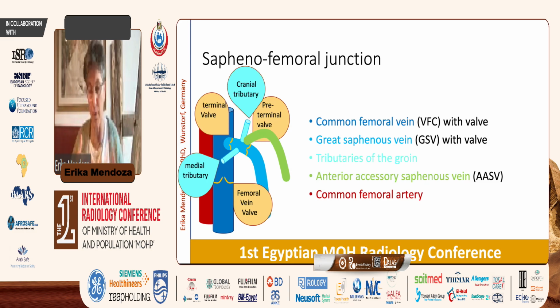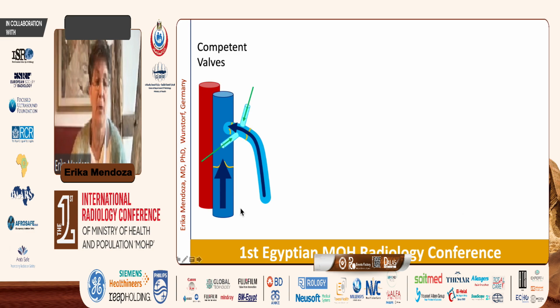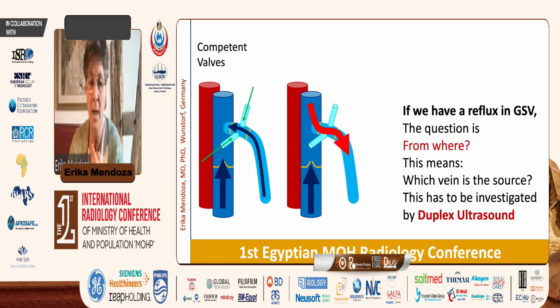The posterior normally is a little bit further down in the leg, so the anterior is the one most important for pathology. And we have the situation with competent valves, where we have antegrade flow in both. And of course, the one draining from the epigastric vein will be footwards, but physiologic. This is very important to have in mind. And then if we have a reflux here in the great saphenous vein, today we have to know where it comes from. I will come back to that later.